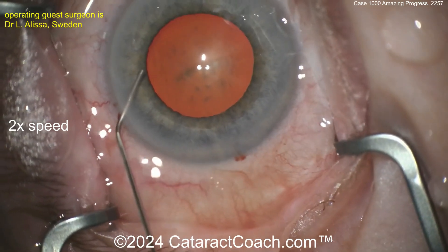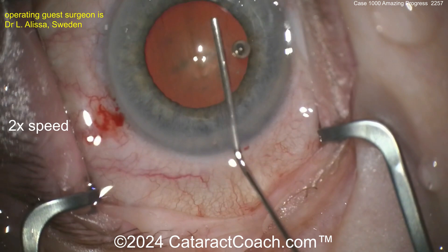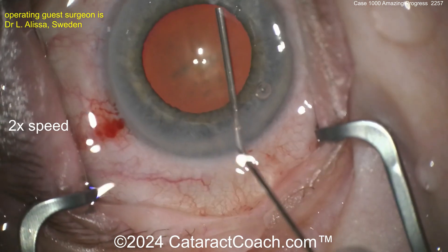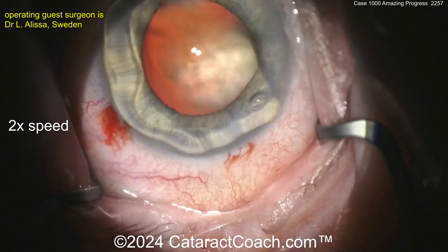Probably going in with some anesthetic or agents to help dilate the pupil. Here comes the viscoelastic — a nice good fill. We've sped the video up so we can get through the whole case in a relatively short amount of time.